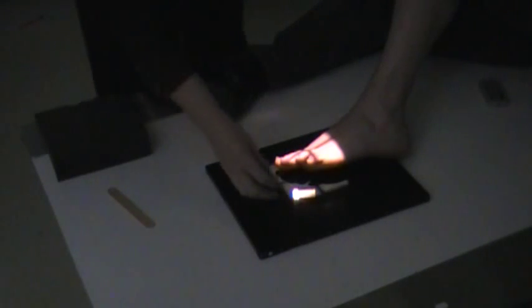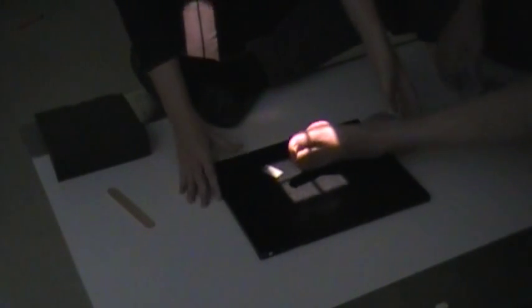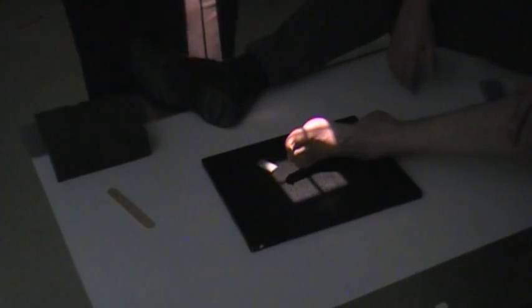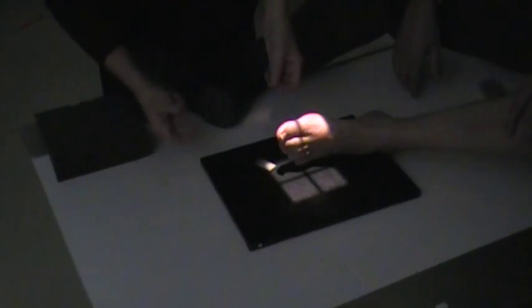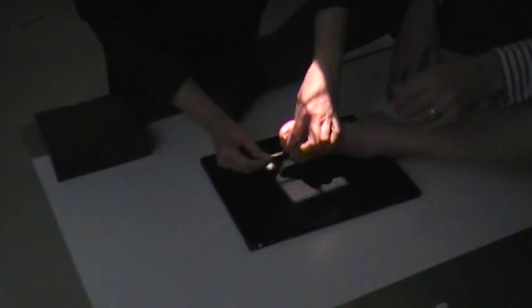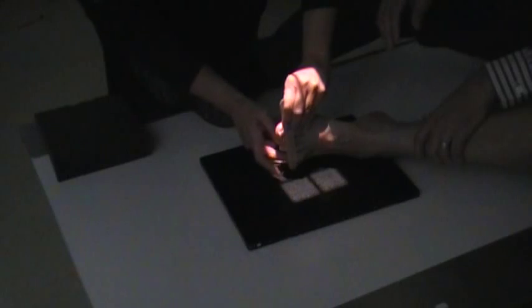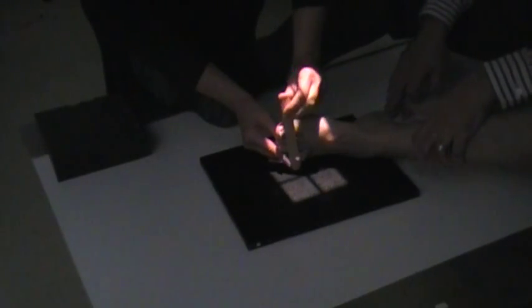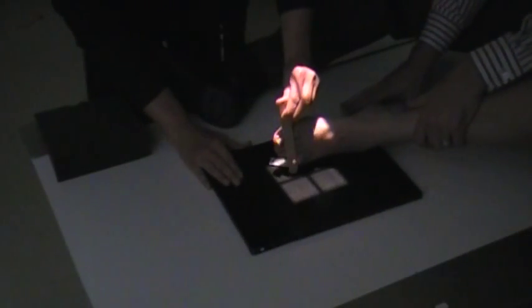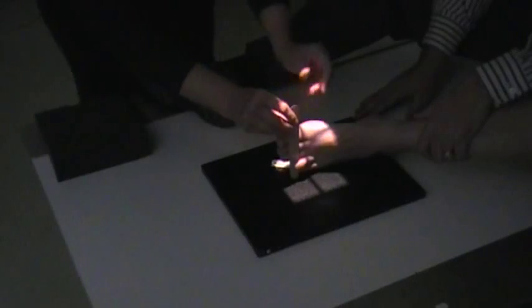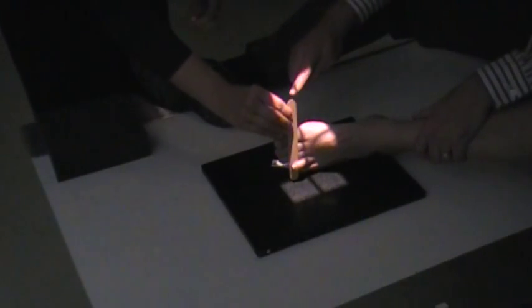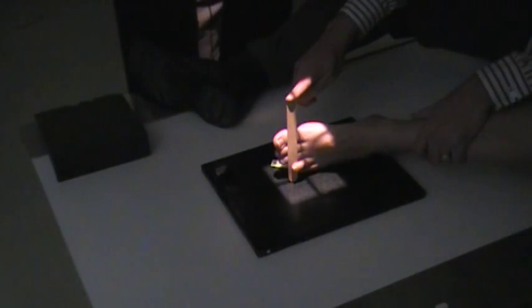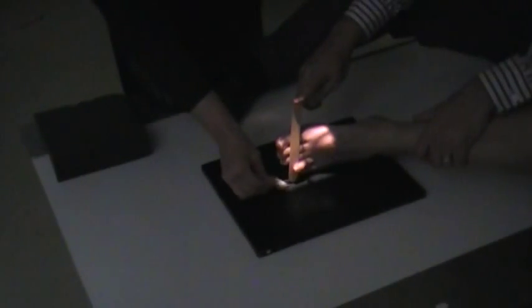Now for our lateral toes, we're going to lay the foot out on its side. This is going to be a medial lateral. We'll say that we're needing to see a lateral of the fourth digit. What I'm going to do is I've got a tongue depressor, and I'm going to separate that toe from the rest of them. I'm going to get that centered right over that area, and then I'll ask the patient just to hold the stick in place while I collimate down tight to that fourth toe.